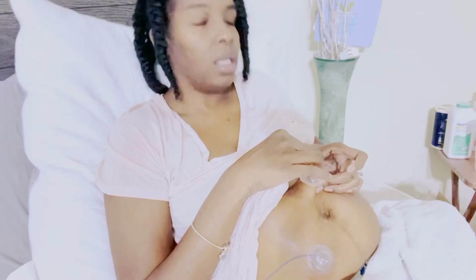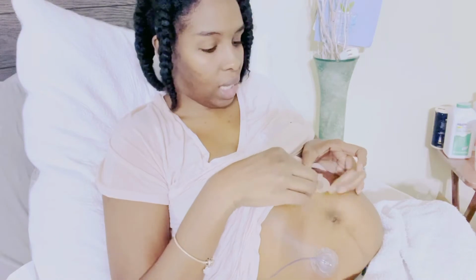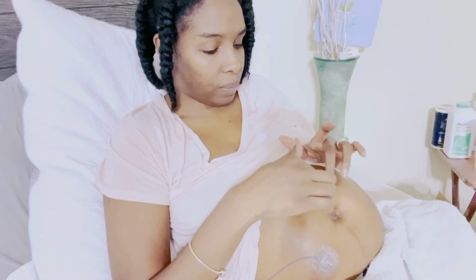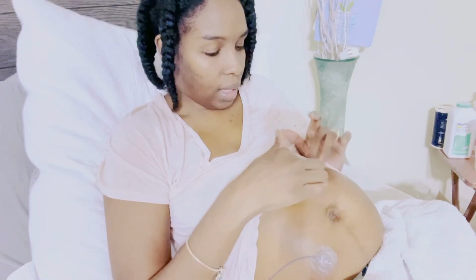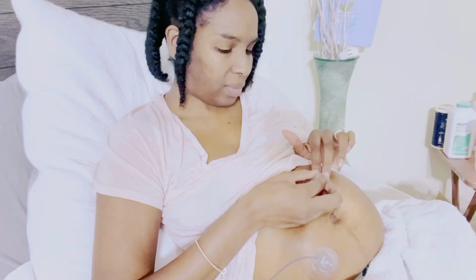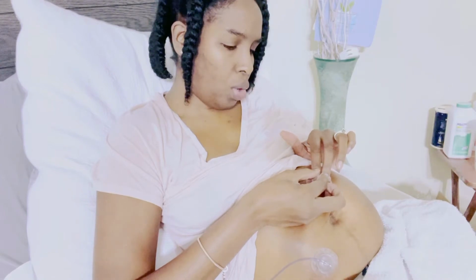Oh God. Oh God. Oh God. All right, so the needle is in, and then you take the tape, the band-aid, and secure it, and then now you're going to take your little fingers and pinch on the sides here. Pinch on the sides and pull the needle out.